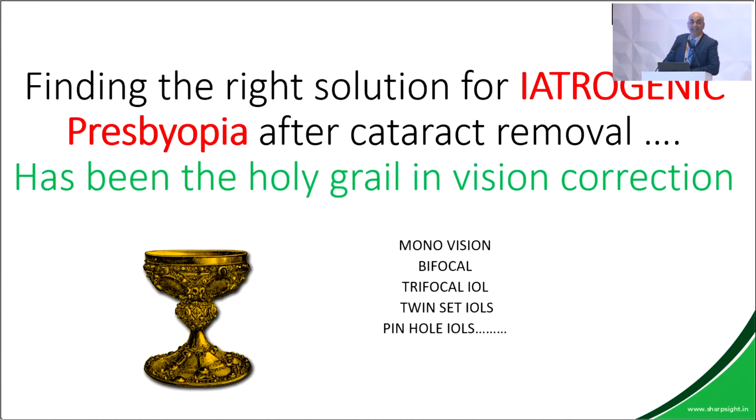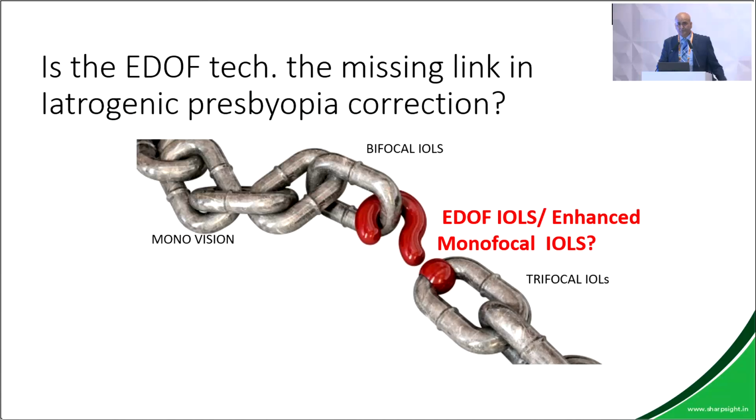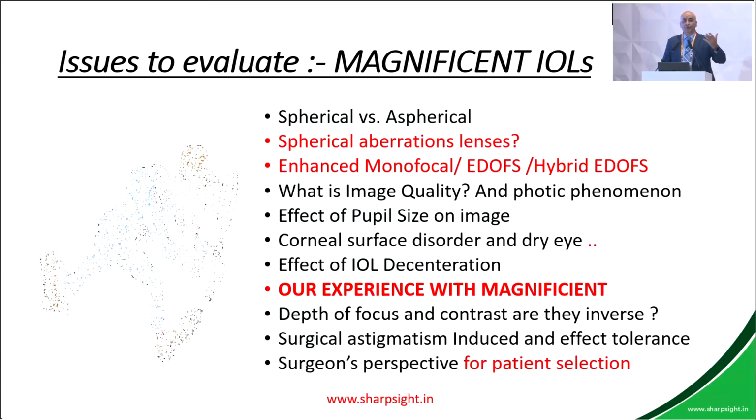Is it the holy grail? Presbyopia correction after cataract surgery, is it the holy grail? And are the EDOF lenses the missing link of correcting presbyopia? I call it iatrogenic presbyopia, because as the doctor, especially in a myopic patient, you're creating the presbyopia; the patient didn't have presbyopia before that. So we'll be looking at a lot of it.